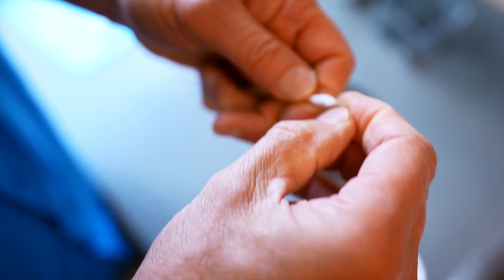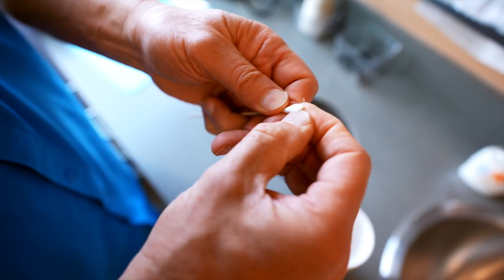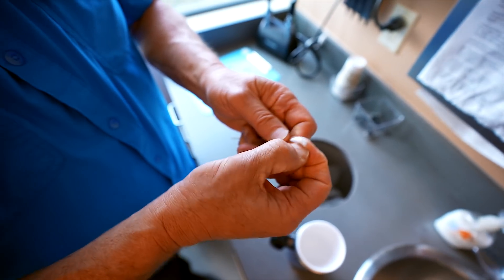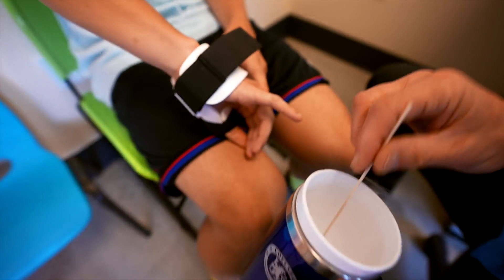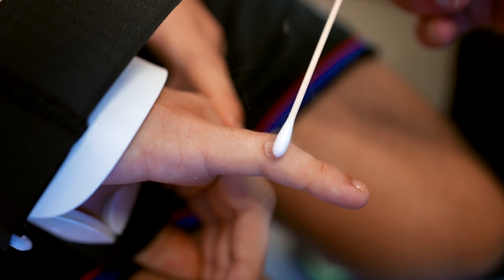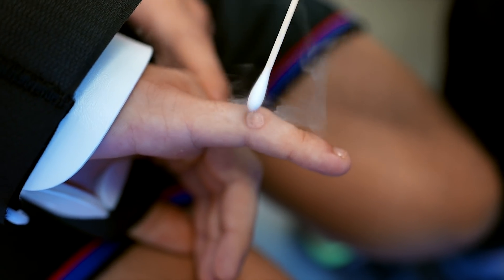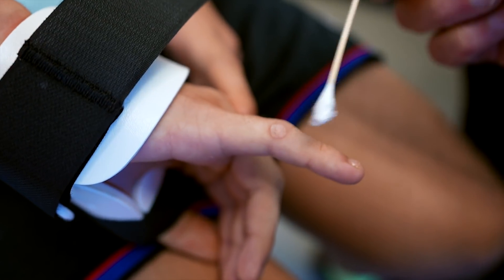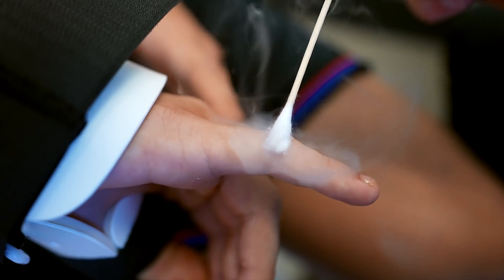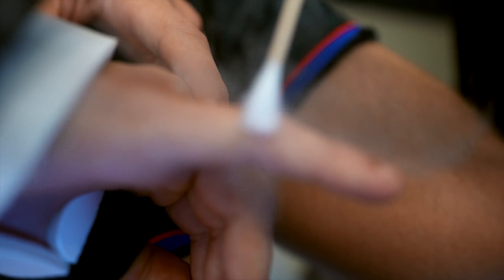So I am loosening up the cotton on the end of a swab. Why? So it will hold more liquid nitrogen, so the freezing will be more effective. I'll illustrate the difference. This is the non-fluffed up swab, which is going to do almost nothing — you just don't see any whiteness happening on that wart. Now I'll get one that's fluffed up. See how that's more fluffy? I'm going to put that in there. Now you can hear the difference too. You see the white? So it would take forever to freeze this wart if I hadn't fluffed this up.